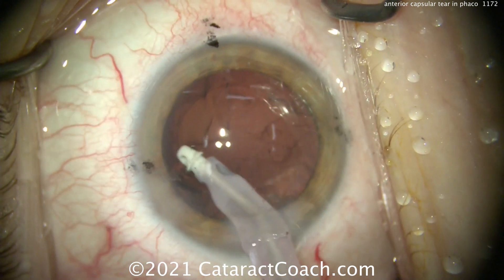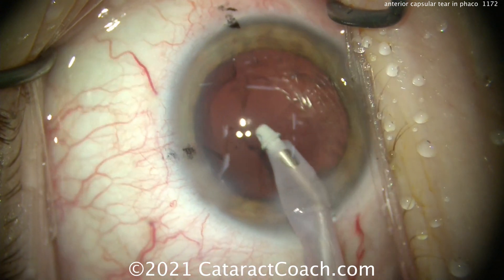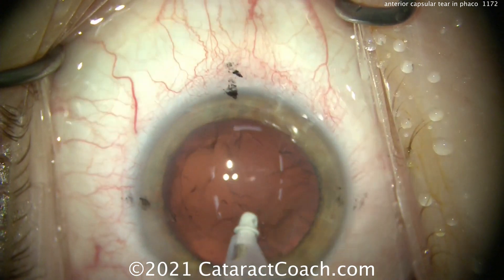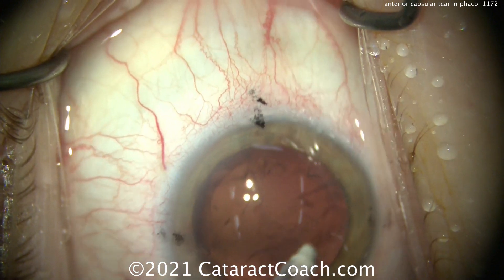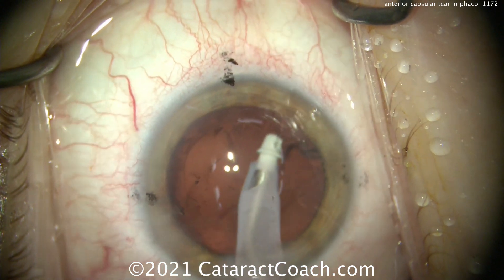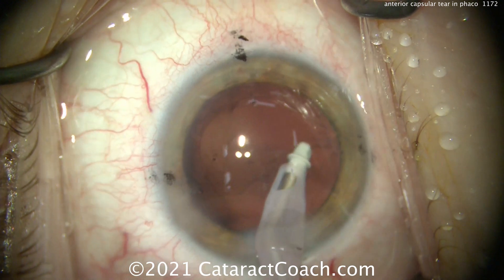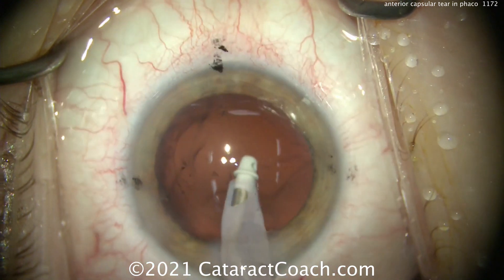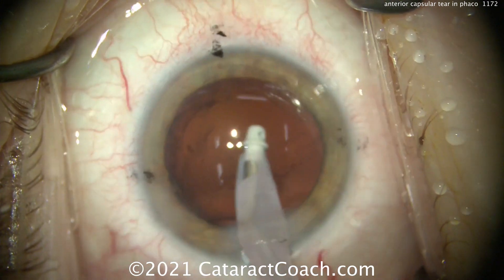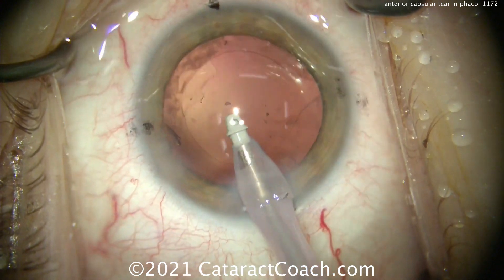Let's remove the rest of the cortex first, the other areas where the capsular bag is stronger. Let's get all that cortex out first, and we'll leave that one area where the anterior capsular tear is for the end. Now, what's the risk? The danger is that the tear can rip around and zip towards the posterior capsule, to the lens equator, and then back towards the capsule. Now you've got a wide-open capsule — and if you have a wide-open capsule, you can't put the toric lens in, you can't put the trifocal lens in. And this patient really wants that lens.